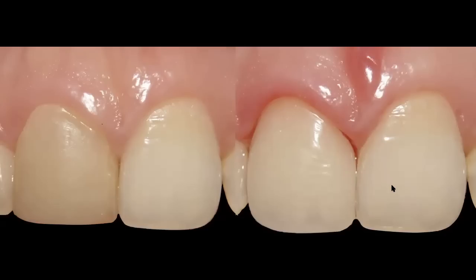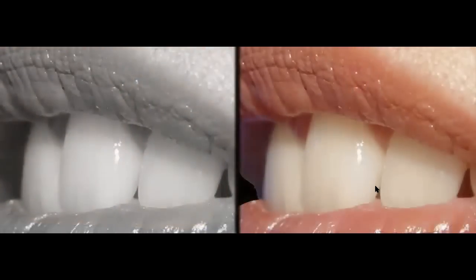So we always do our final shade evaluation either a couple of days or a couple of weeks after we deliver the restoration. And this is now 30 days later, and you can see that on a black and white photo, this is the tooth that I restored.